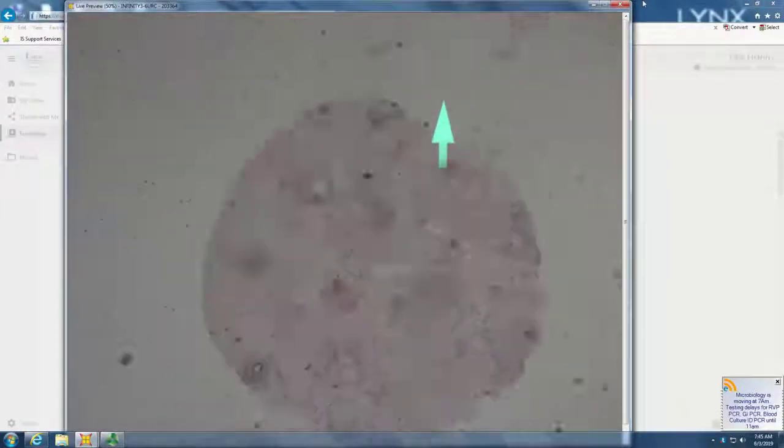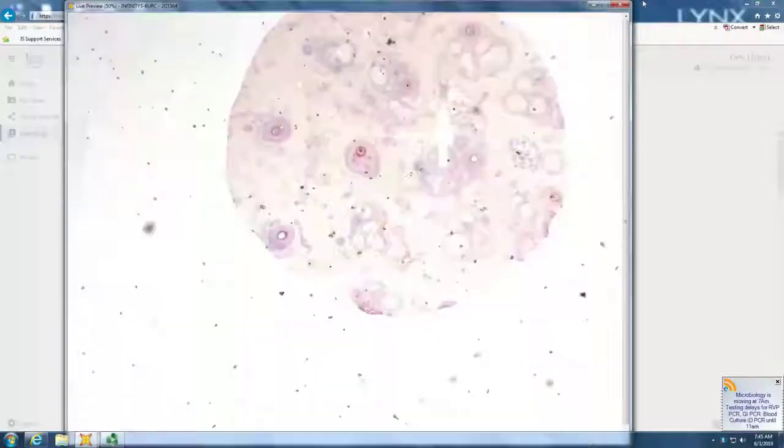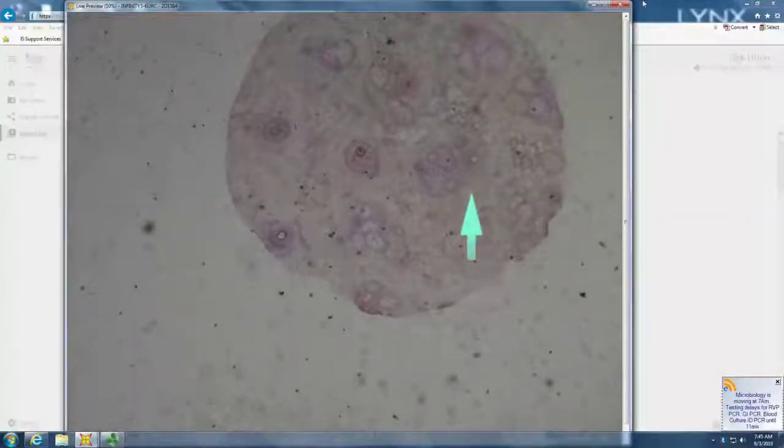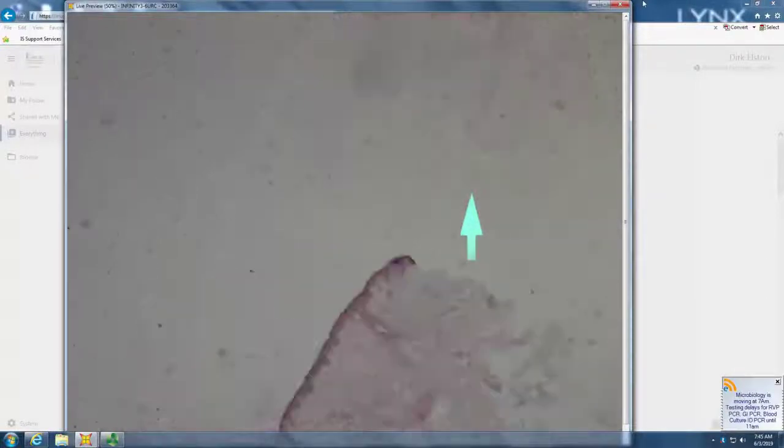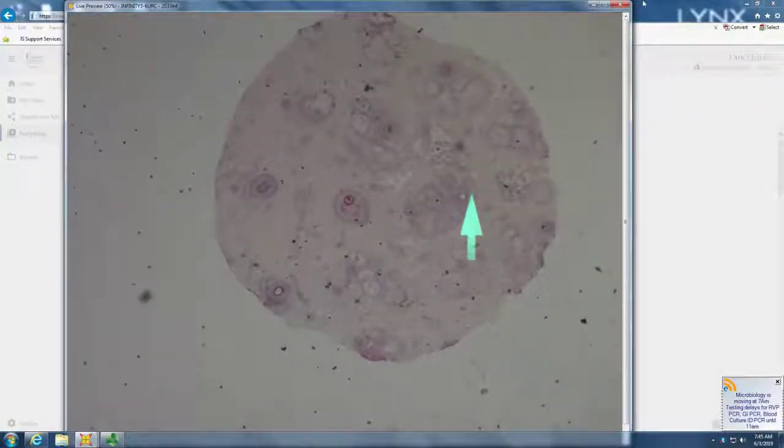So any other things you want to look at? So I don't see much of an inflammatory infiltrate. But where would that be? We're at the isthmus, so we're too high to see it, right? Because you'd expect it down around the bulb. And here we're at the isthmus level. So in transverse sections, it's not uncommon to miss the diagnosis of alopecia areata. Diagnosis is made better statistically in vertical sections because you're at the wrong level to look, unless you have serial sections that carry you down, or unless the hair is so miniaturized that you can see it.